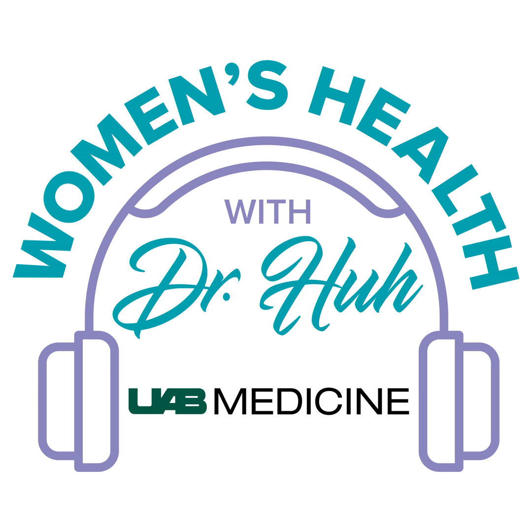The second thing specific to uterine fibroids that I will mention is a new technique called radiofrequency ablation of uterine fibroids. In this procedure, the patient gets 2 incisions, one for a camera. It is a 5 millimeter, or I tell patients roughly the size of your pinky, incision that's somewhere near their belly button, and then a second incision right above your pubic bone, sort of at the top of the hairline. And we are able to view the fibroid through one incision, and then we use a laparoscopic ultrasound device through the other incision.